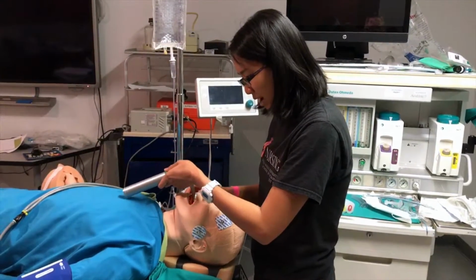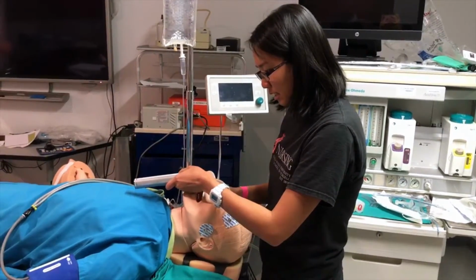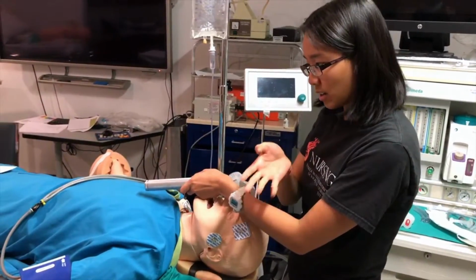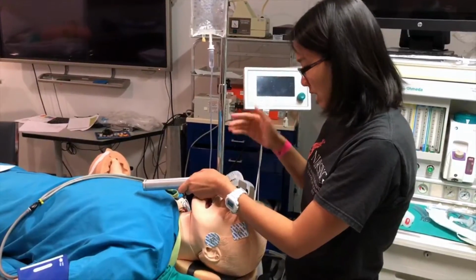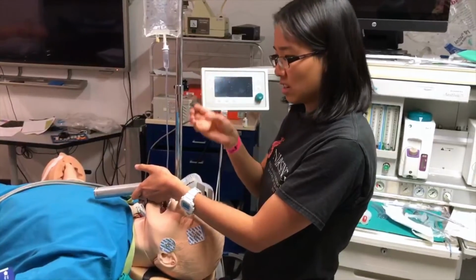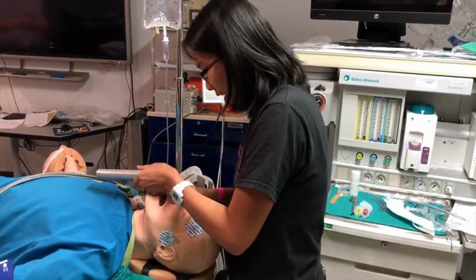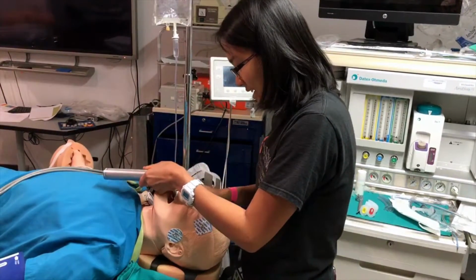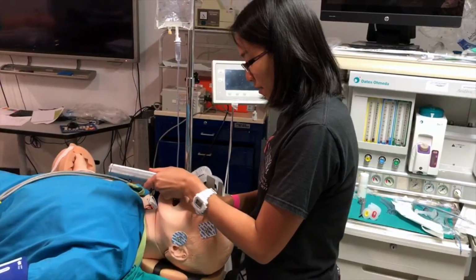So you want to go in from the right side of the mouth, and basically your goal is to displace the tongue over to the left, so it's out of the way, because the tongue is a really big obstructive force when you're trying to intubate. In the mannequin, the tongue does not move, so just pretend with me. But you go in from the right, and you want to simultaneously move the laryngoscope to the midline as you displace the tongue to the left.